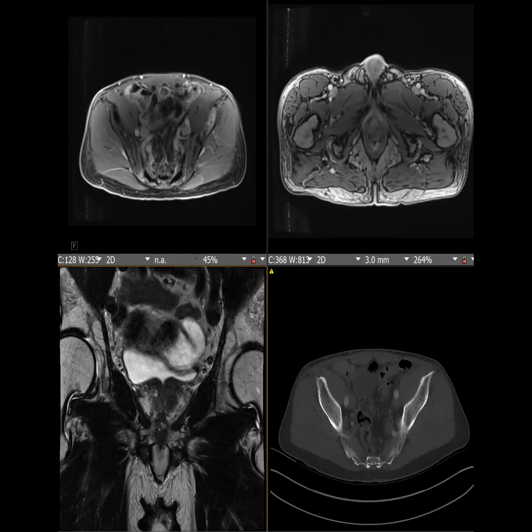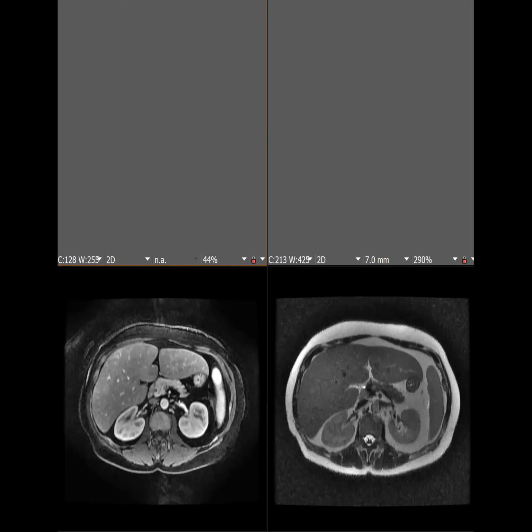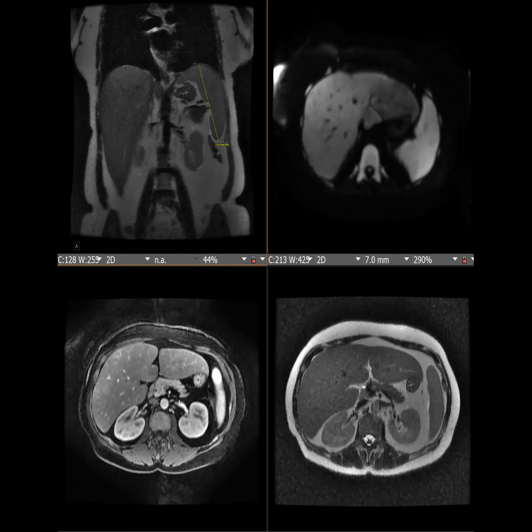I have another one. This one, I think, was one of the best cases that I've seen so far. It was a young lady, in her 30s or 40s, let's say. She was referred to us for a liver lesion, but that's much, much less interesting than the finding that I wanted to share with the group. One thing was that she had some splenomegaly going on. A lot of people have it, and we sometimes write it off.